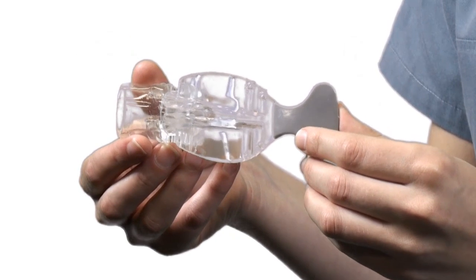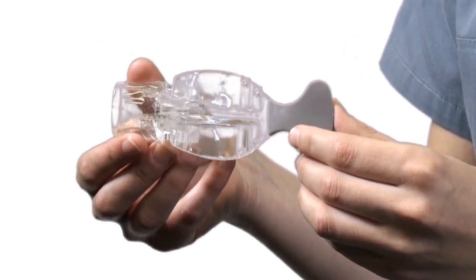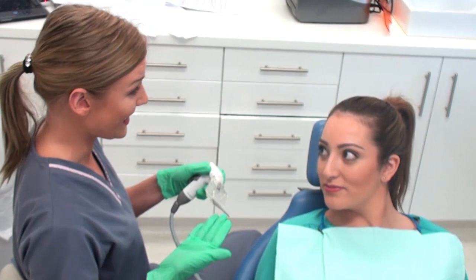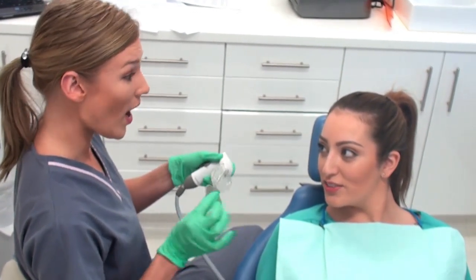Once you have chosen the correct mouthpiece, it's time to place it in your patient's mouth. It's always a good idea to explain to the patient what you're about to do and what they should expect to feel when the mouthpiece is in their mouth. This way you can reduce anxiety and increase acceptance.